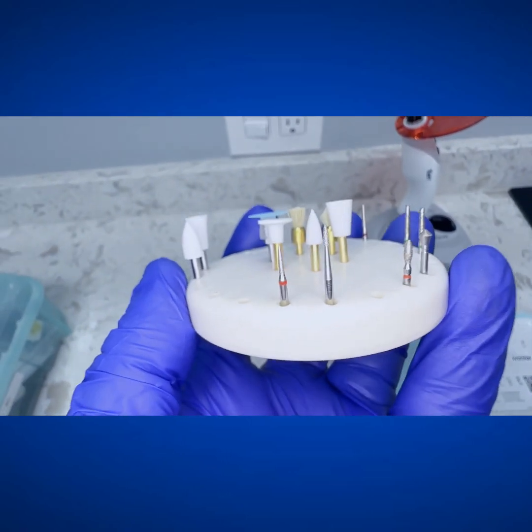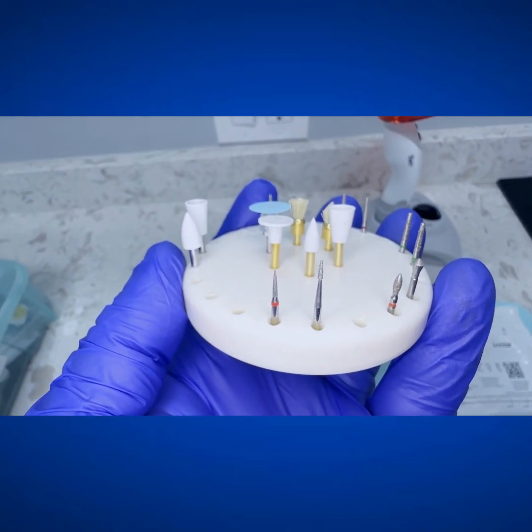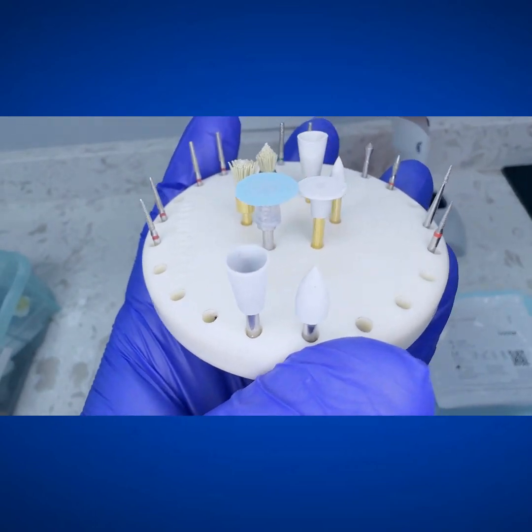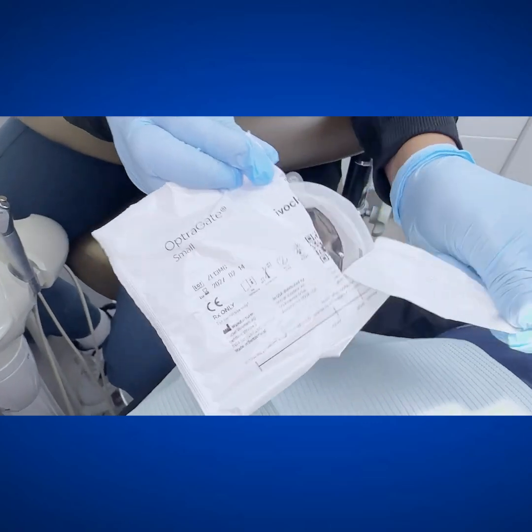You can see some of these flame burs are pretty specialized for getting in between, different sizes for different things. As dentists, we know we're always going to use something else, but these dye gloss polishing points and the PDQ points are my workhorses for getting that nice glaze and shine.